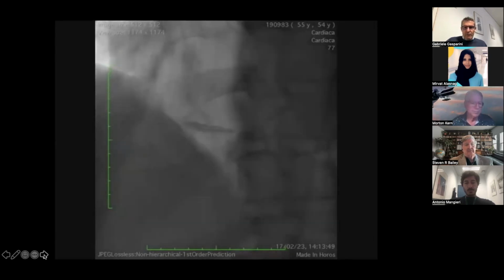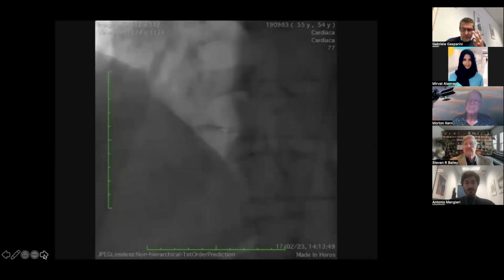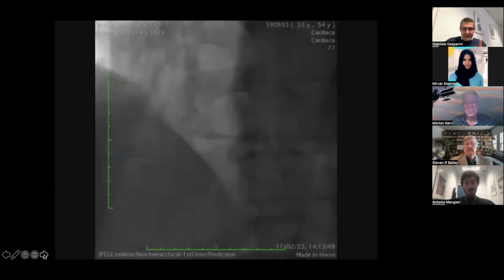So for the rationale of this technique, we have several other interesting pictures, also with some information coming from imaging. We have also IVUS and OCT as well. So the rationale of this technique is that when you apply sliding movement to the inflated cutting balloon, the benefit that you can reach in terms of creating some cut or some fenestration is higher compared to a traditional cutting balloon inflation because of two main mechanisms. The first one is concentrated force, and the second is progressive cutting.